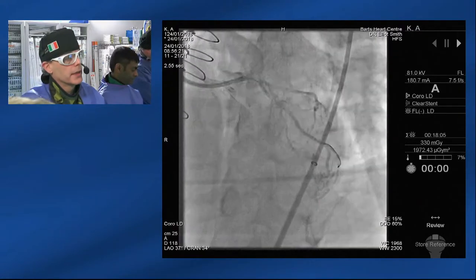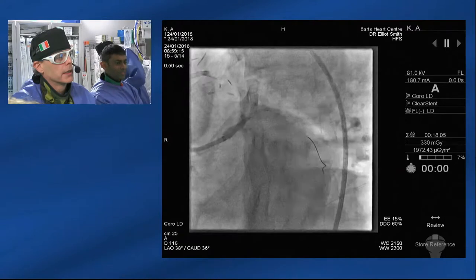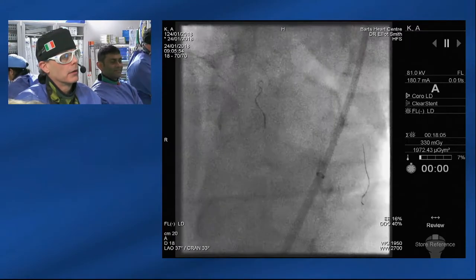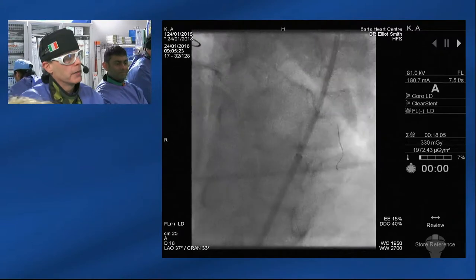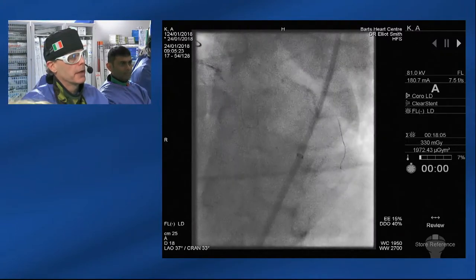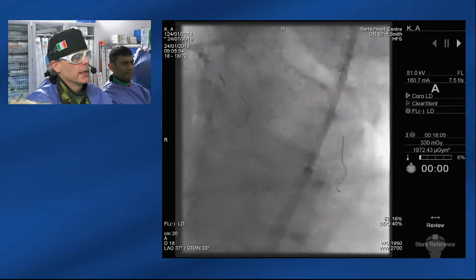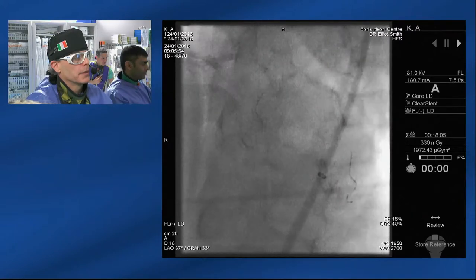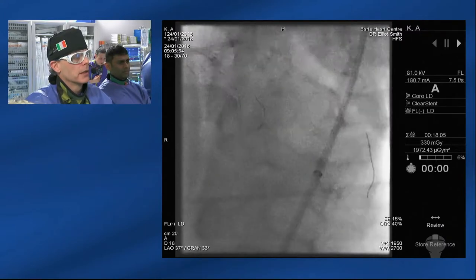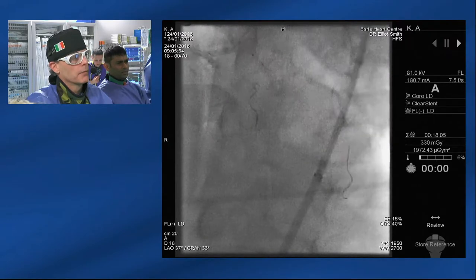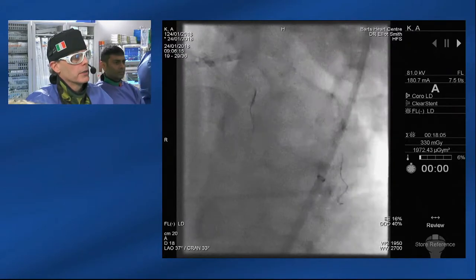This is the IVUS acquisition showing where the cap is. This is a Turnpike LP with a Sion wire going down the vein graft and back up the LAD. In the vein graft anastomosis the wire will tend to prolapse, but we've got enough of the vessel that wasn't a major concern here. The LP goes smoothly around that angle. It's a Sion wire — a relatively low gram tip wire. This is the Sion wire going into somewhere we do want to be.